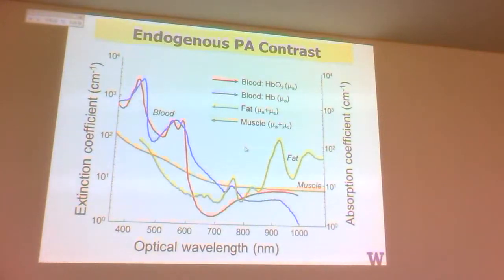But the ones for intravascular photoacoustics are primarily looking at the fat. They're trying to look at large lipid pools, because ultrasound can do that, but does not do it well. Photoacoustics can do this very well, and that's critically important in judging what you're going to do in interventional procedures, whether it's a stable or non-stable plaque, or characterizing lesions while you're doing intravascular pictures. So the intravascular folks have used spectral characteristics to identify fat, and the blood folks have used the spectral characteristics of oxy and deoxy to look at oxygenation.